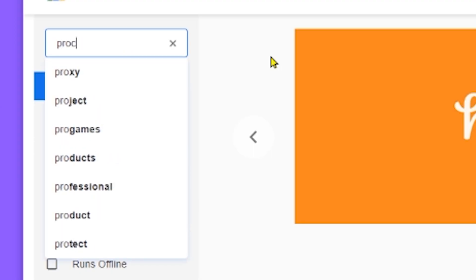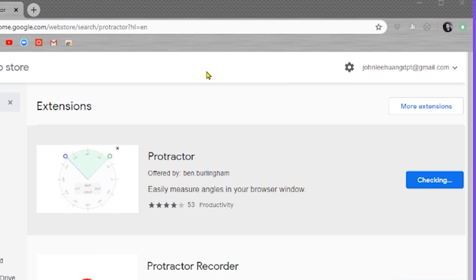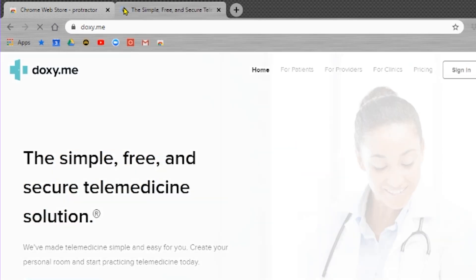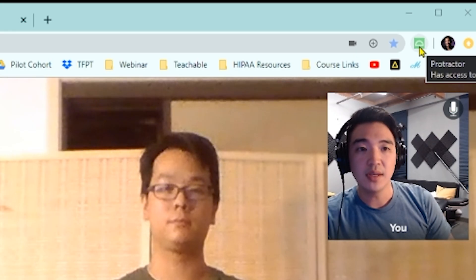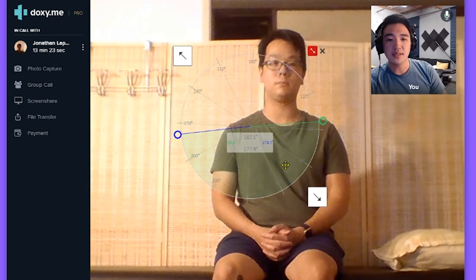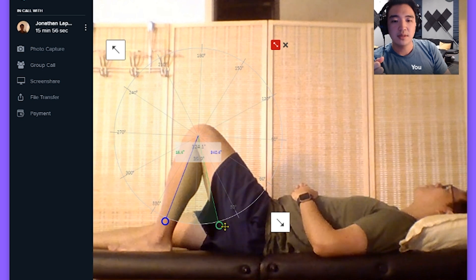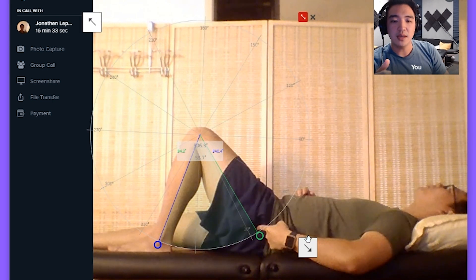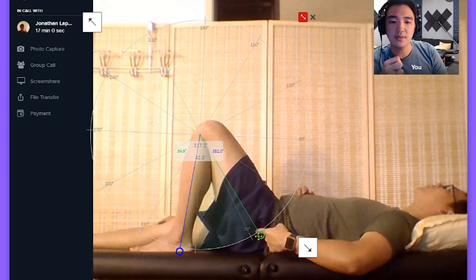First things first, head to the Google Chrome store, download the protractor extension — should be the first one — add it to your browser, then head over to your telehealth app. I'm using doxy.me. Now go ahead and click. You'll get the protractor on screen. Align the center onto the joint you want to measure, then you can move the arms, make the protractor bigger or smaller, and move it along with the patient. And that's pretty much it.